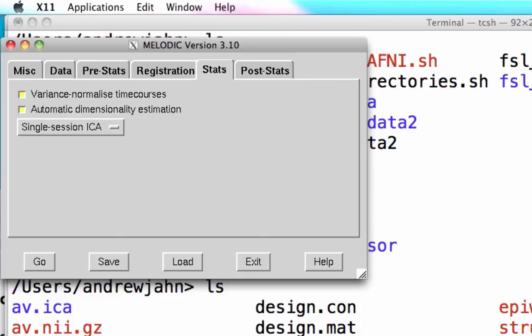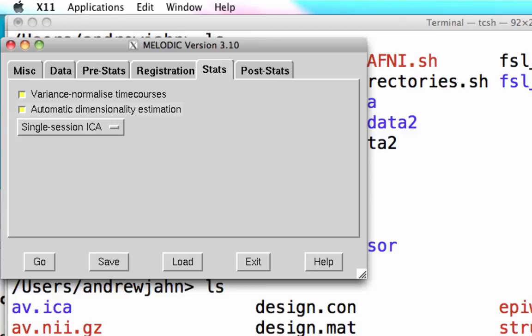There's one part of the tutorial on the FSL website I'm not going to cover in detail, but it talks about how many independent components you should estimate — basically what this is doing for you automatically. You can uncheck this and select the number of components yourself, but you probably shouldn't do this because computers are smarter than you are. They're building robots and computers that can basically find and kill people — so just get on the good side early. Have it do it automatically. If you select too few components, it's going to underfit. If there are too many, it's going to overfit. But the algorithm — the computer — will do it automatically for you. Post-stats is how you threshold and output it.